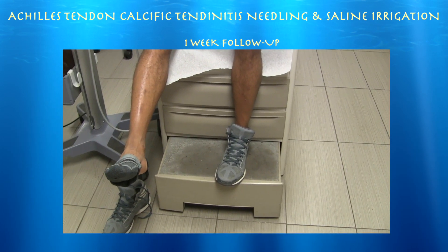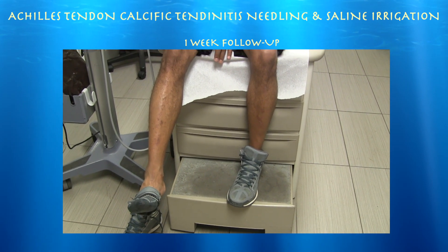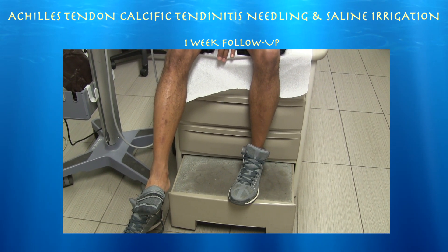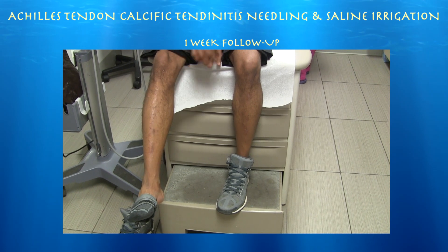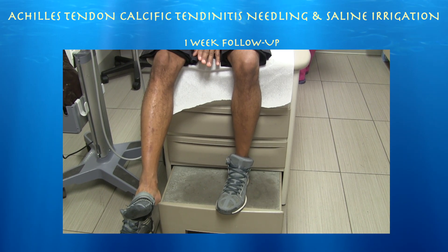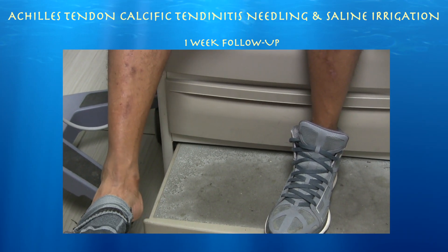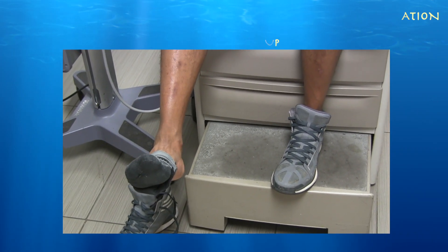About a week ago we irrigated a calcium deposit in this Achilles tendon with some saline, tried to break it up a little bit with the needle, and didn't aspirate any calcium. I thought it was behaving almost like a calcific tendonitis that you see in the shoulder. He was really having a hard time walking on it before and was limping using crutches. At the follow-up he states it is still tender but he can walk. He reports that what was done last time helped enormously — the next morning he had very little soreness and could walk somewhat normally, which was his best day yet, though going up and down stairs was still pretty hard.